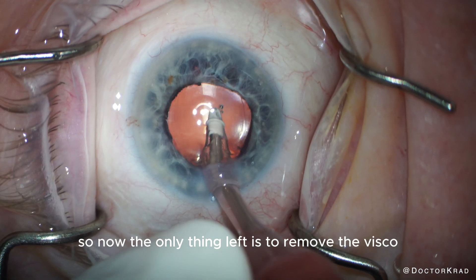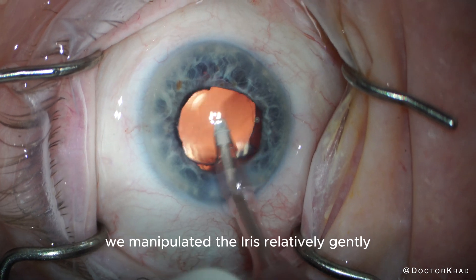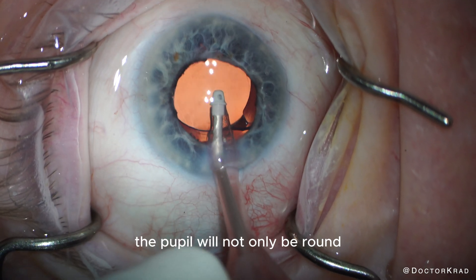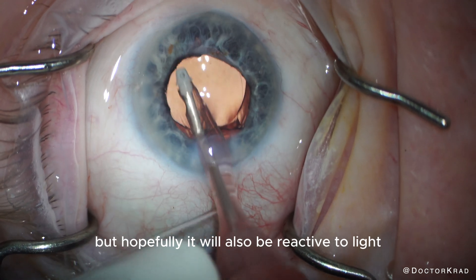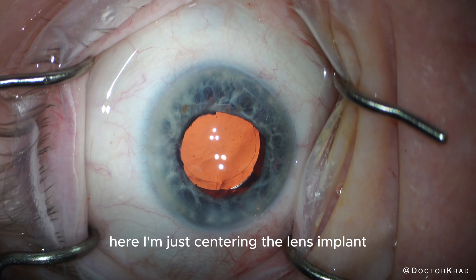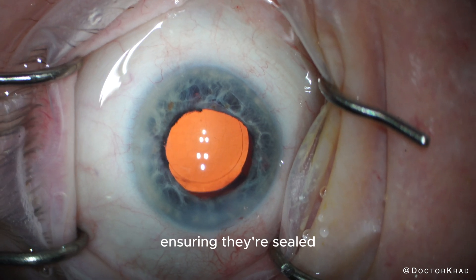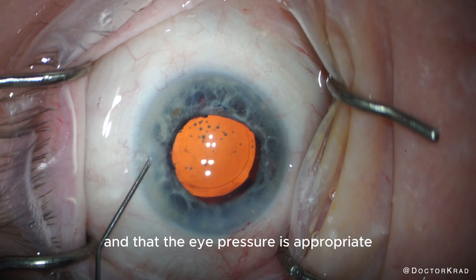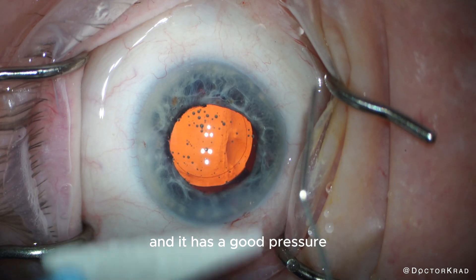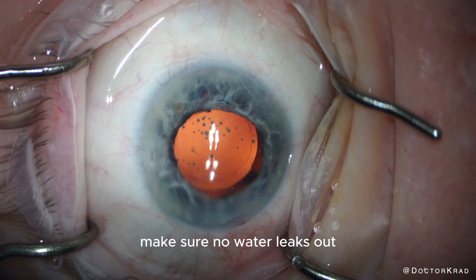So now the only thing left is to remove the viscoelastic and to center the lens implant. Although the pupil may look irregular now, we manipulated the iris relatively gently. I'm hoping that after the dilation wears off, the pupil will not only be round but hopefully also reactive to light, because we fractured that dense fibrotic band on the pupillary border. Here I'm just centering the lens implant — it looks like it has good overlap with the capsulorhexis border. Then I'm going to hydrate my incisions, ensuring they're sealed and that the eye pressure is appropriate. I tap on the eye, notice the pressure is high, release some fluid, tap again, and it has a good pressure. Now I'm going to stress test my incisions — after drying them, I tap the eye and make sure no water leaks out. We now have a perfect seal.